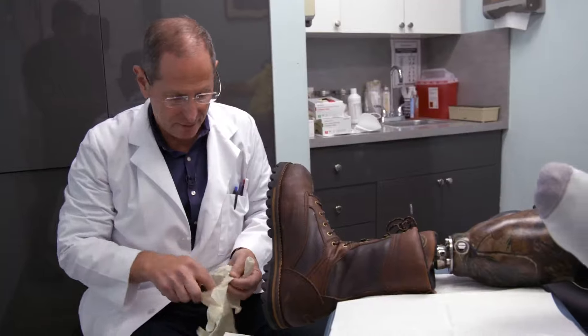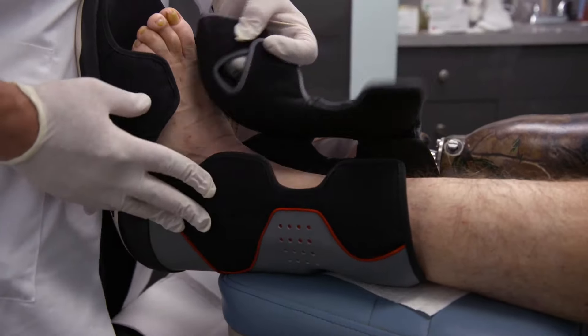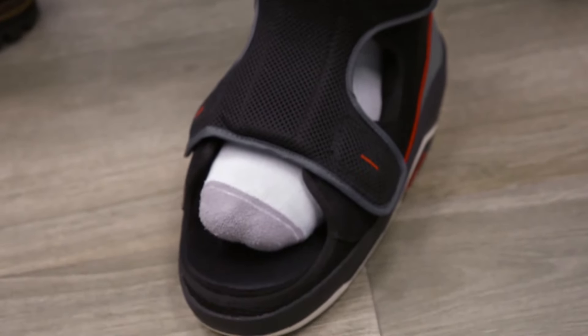And I see you're wearing the Foot Defender — so this is working for you? It's very comfortable. I don't know what it does as far as pressure relief and that kind of thing on the scientific side, but when I've used it, it seemed to accomplish what Dr. Hanf wanted to accomplish, which was healing. Overall, the problem statement and how they solved it — I think it was ingenious and I think it's really going to change lives in the future.